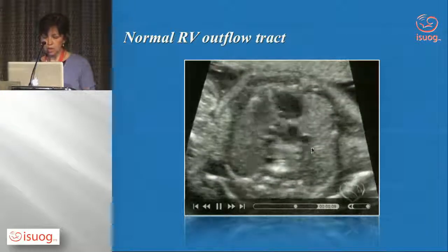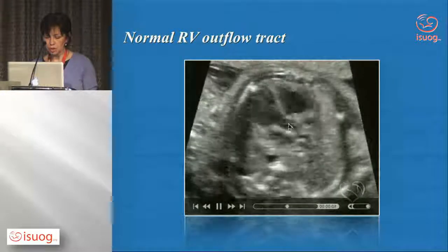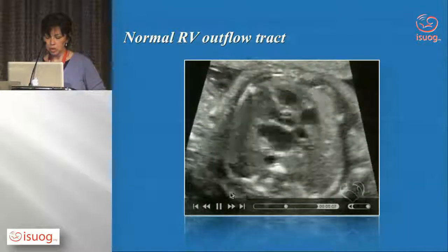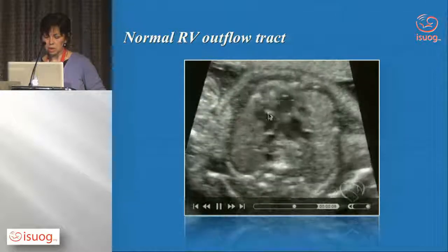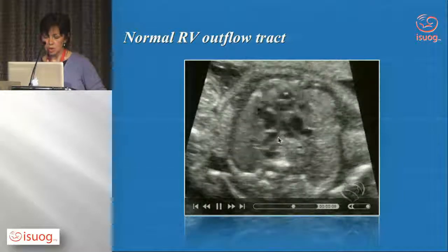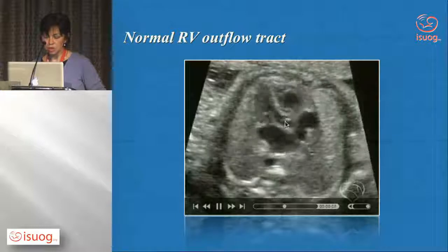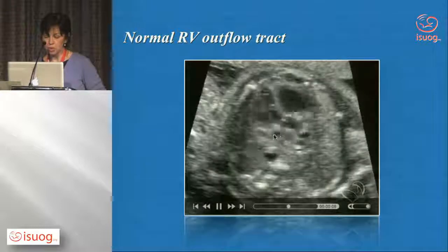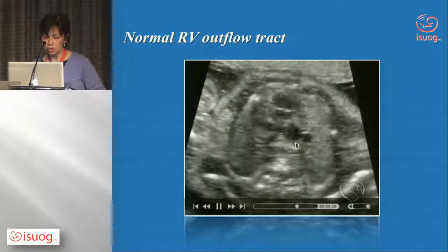So we still have here, the beginning of this clip is a very, very short clip, but we go from the left ventricular outflow tract to the right ventricular outflow tract, with the pulmonary valve here opening and closing. We can see that crossover. So left ventricle coming towards the right shoulder, right ventricle coming across at 90 degrees at their origin. We have here the left ventricle, the proximal aorta, and that's the aorta, already starting to come into your 3-vessel view. And we see here the bifurcation of the pulmonary artery.